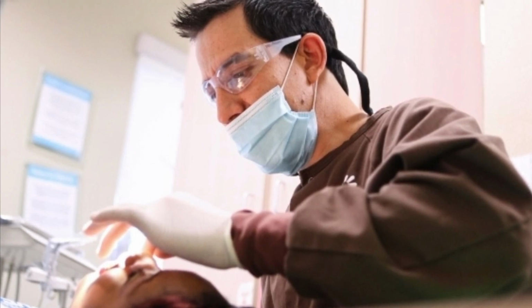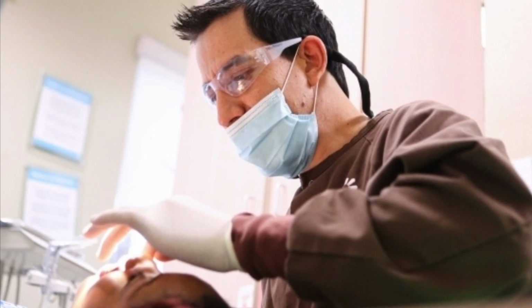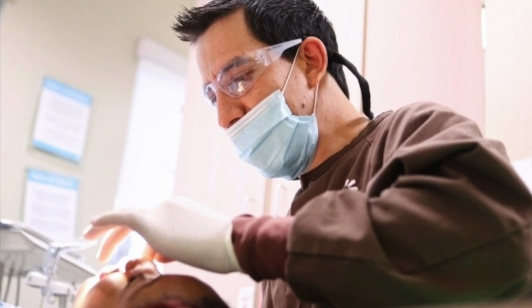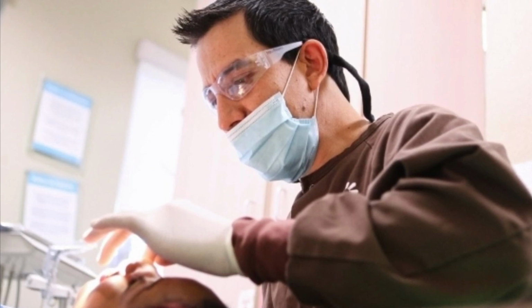Again, reaming action is a repeated clockwise rotation of the instrument, which will shave the canal walls and give a cross-sectional preparation approximately round, and reamers are usually more effective for this function. We use reamers to do this shaving of the walls.